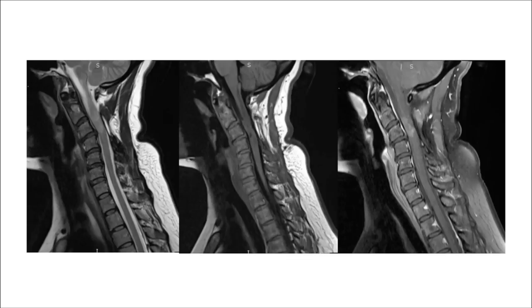All right, let's move to case two of the virtual slides. This is a 43-year-old woman. And this is the MRI of this patient. You have a T2 sagittal image that shows this hyperintensity in the cervical region. This is a T1 pre-contrast, and this is a T1 post-contrast, and you can see that there's some enhancement there. So it's a well-circumscribed enhancing mass in the cervical region.